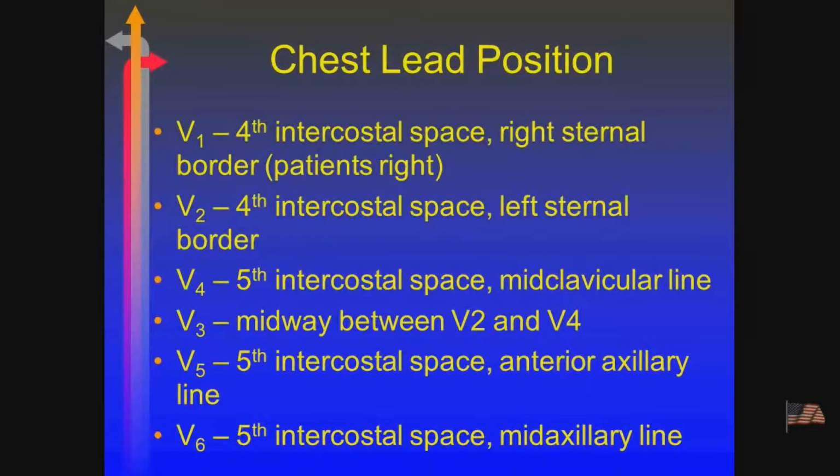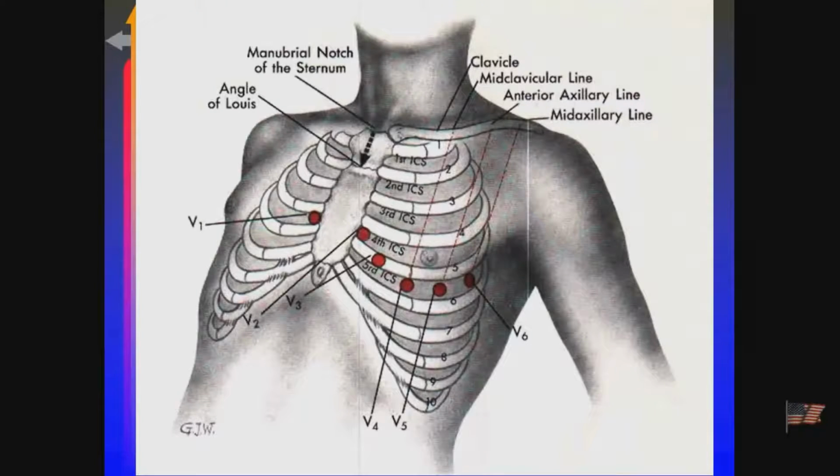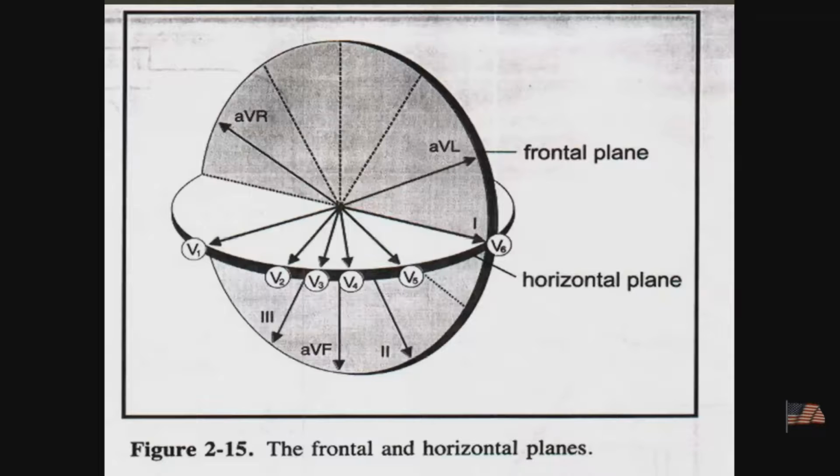Placement of the chest leads. Going back from Mary's class, as far as doing EKGs, you should know the placement. I would feel comfortable saying which lead is in the fifth intercostal space, mid-clavicular line, and you would have to tell me V4. Old news? Okay. So again, how they're placed is critical for measurement, with 4, 5, and 6 following a straight line in the fifth intercostal space. And they're kind of just giving you that view where the negative pole, again, is in the center of the chest, and the positive pole is going out to each of those individual electrodes.